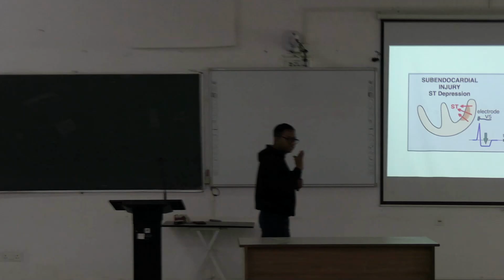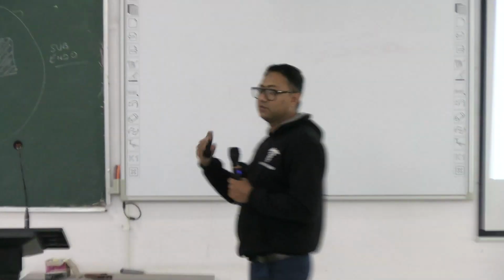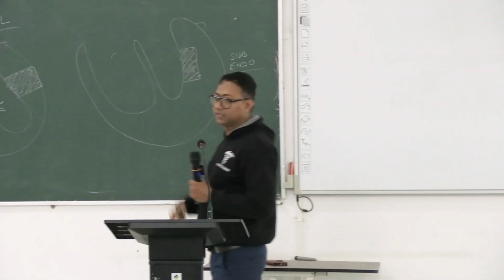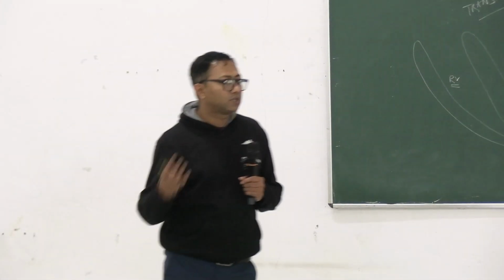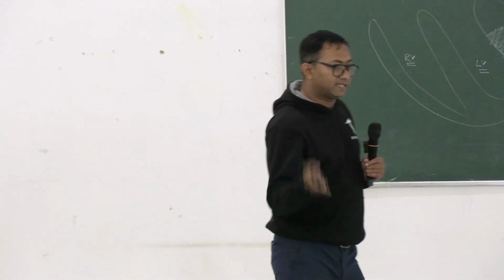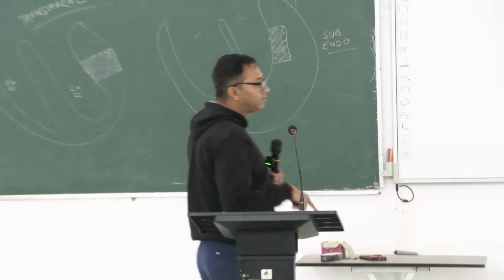Okay? So there is a sequence of ECG changes that you may not remember right now. What happens first, what happens at last, but anyway you need to remember all the changes. You need to remember that acute coronary syndrome may be characterized by ST segment depression or ST segment elevation or a deep Q wave or T wave inversion.